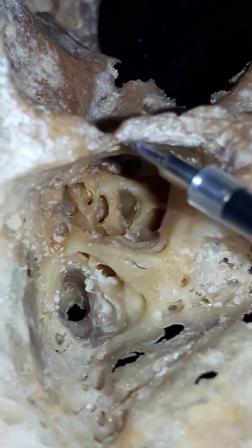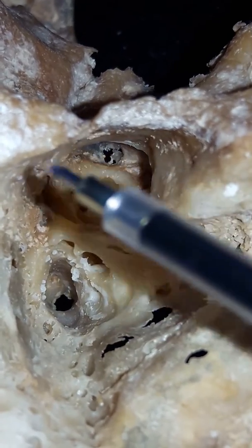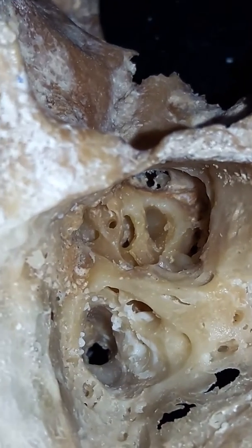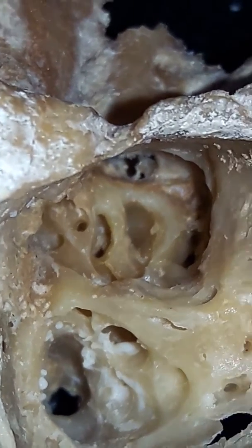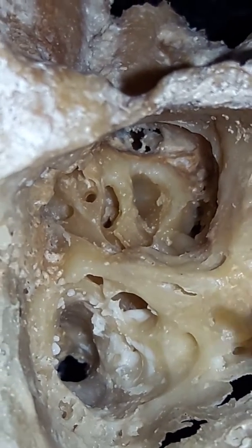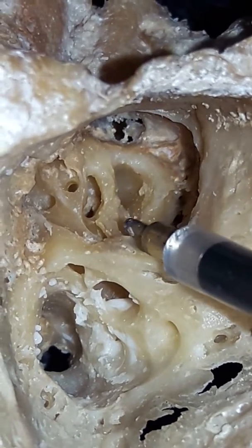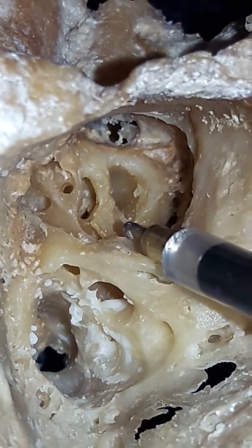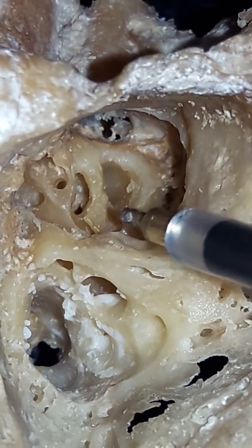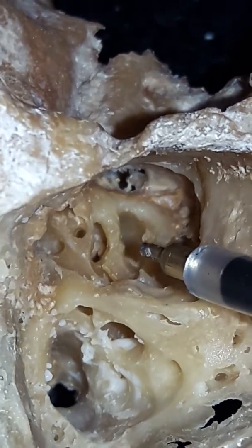Now I am going to explain various cochleostomies and cochlear drill outs. This is the cochlea here, and this is the labyrinth. Let me explain these cochleostomies and cochlear drill outs. Let me focus closer. Yes, this is the round window area, and this is the oval window here. This round window leads to the scala tympani.